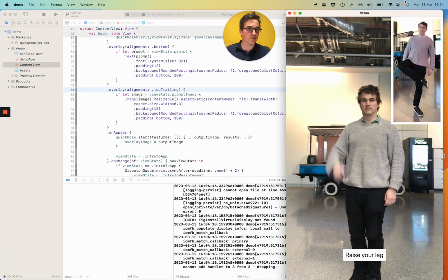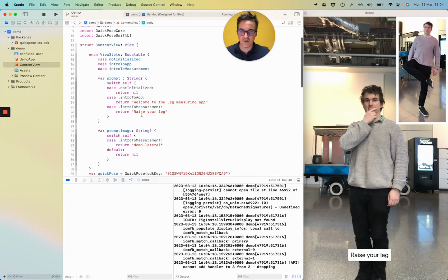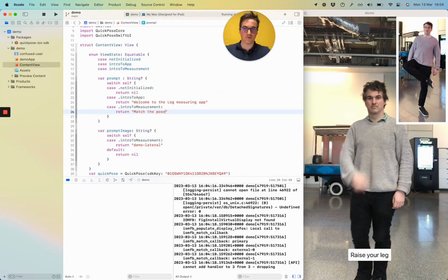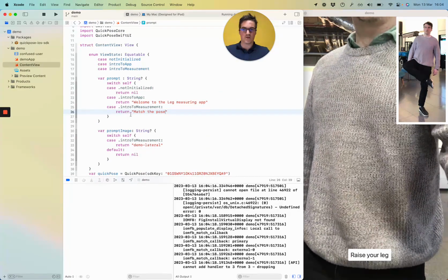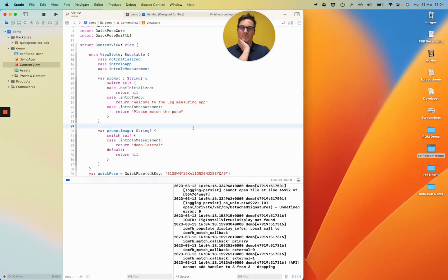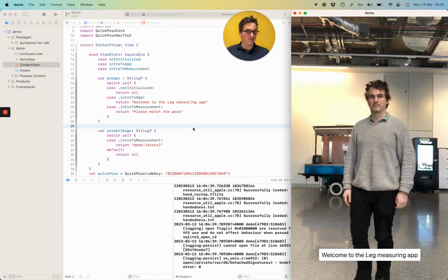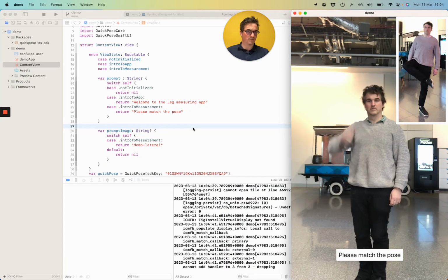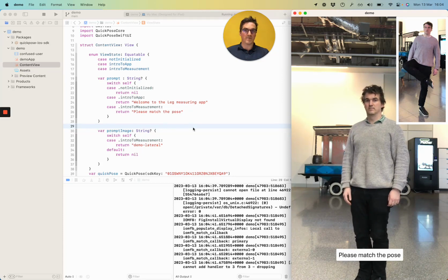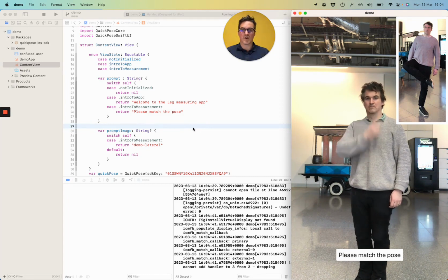Okay, there we go. Scratching my head, my text prompt is still a bit unhelpful, so I'm going to call it "match the pose." Or maybe more politely, "please match the pose." Welcome to the leg measuring app. Please match the pose. Okay, I think that's pretty good. We're kind of coming to the limits of what we can do with our confused user video.